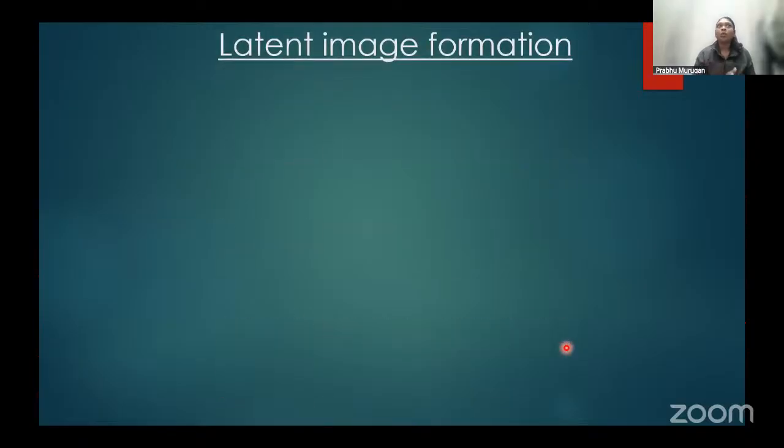Yeah. So now we saw how X-rays are formed and captured. Now we have to see how the image is being formed, right? You have the receptor, and X-rays are going to hit it. It is going to create an invisible image. This invisible image is called the latent image. Only when you process this invisible image will you get the final diagnostic image. That only you'll be able to see. Okay. So X-rays, everything is invisible, right? Nothing is going to be visible to our eyes. So invisible X-rays fall on the X-ray film, and you get some kind of a background or scaffold, an invisible image. This invisible image is called the latent image. Okay.